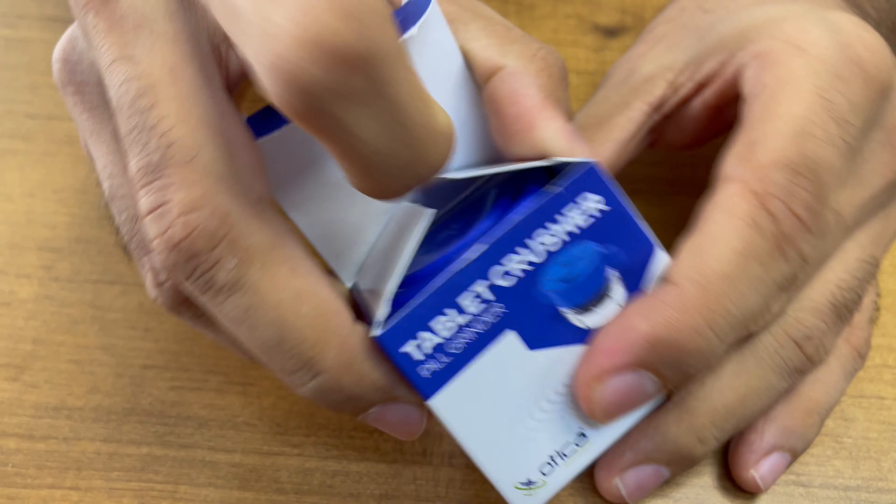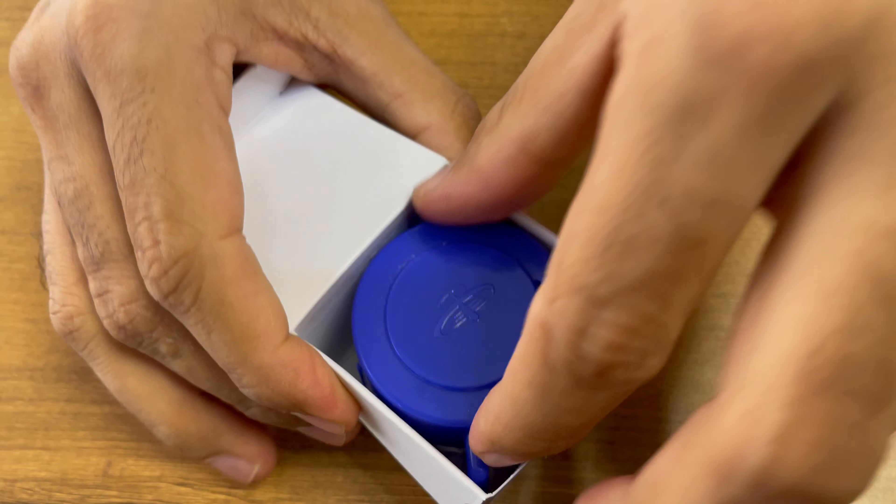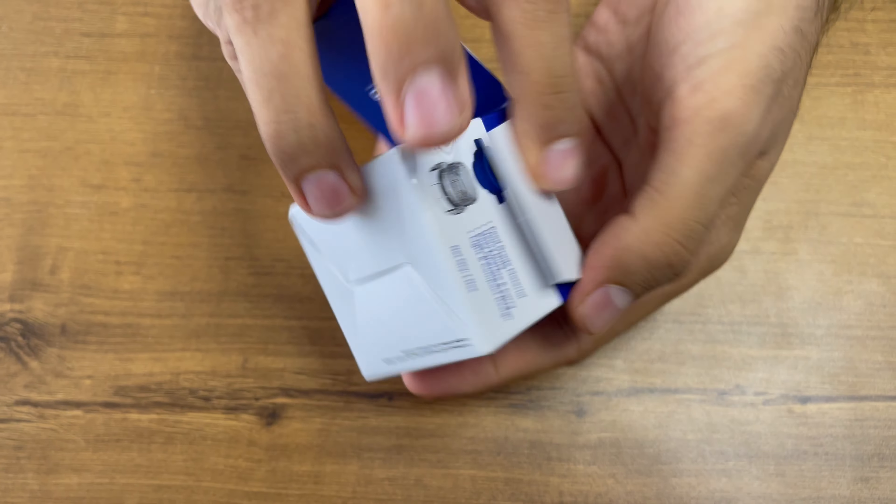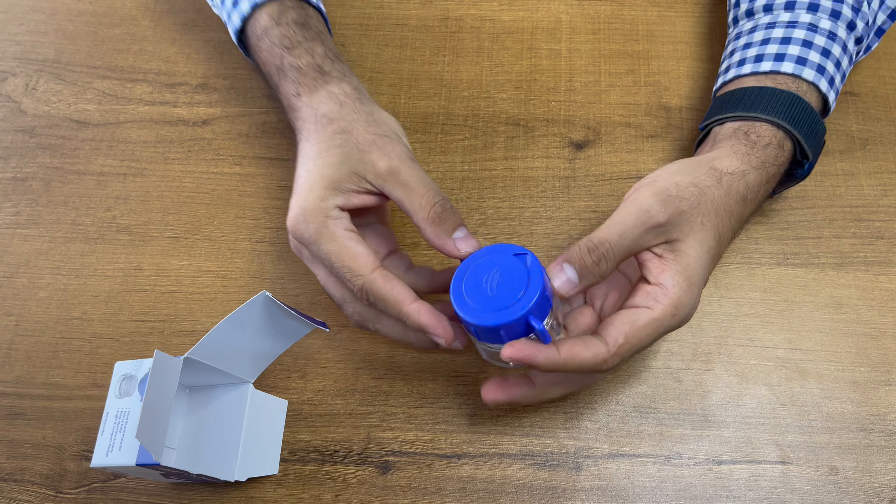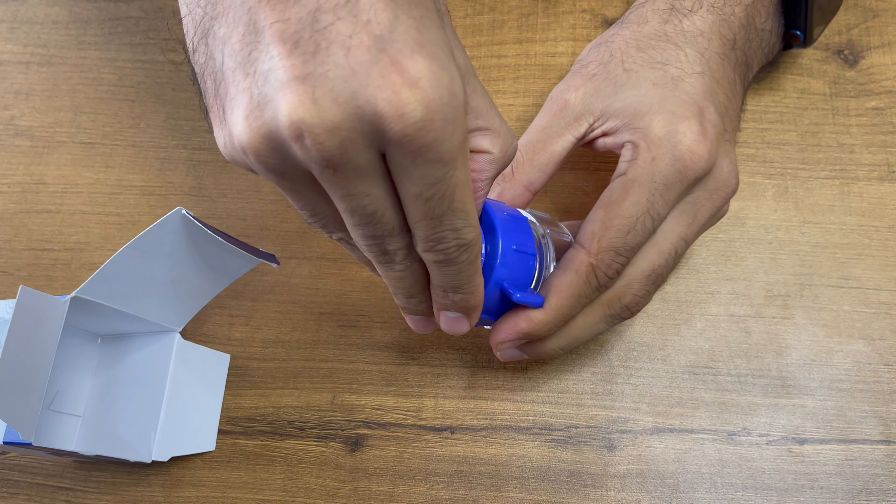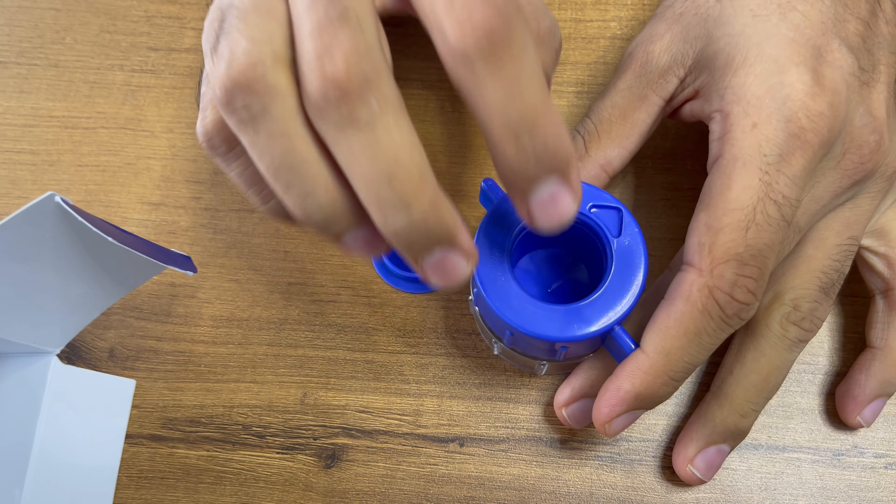We are going to unbox this device. It is very simple in function, very useful, and strong enough. You can see they have given storage for the pills - you can store the pills here.